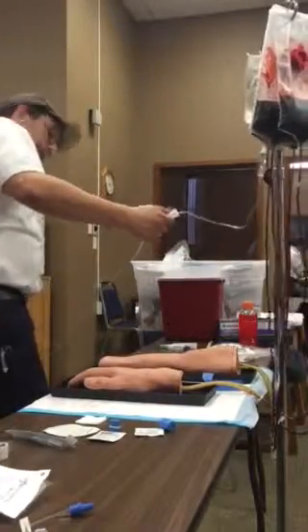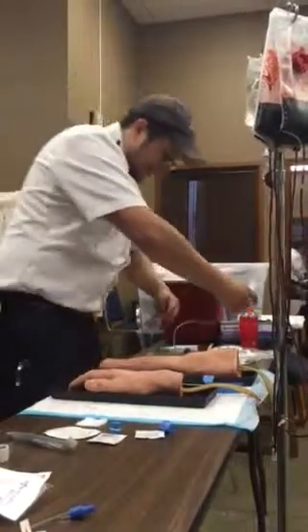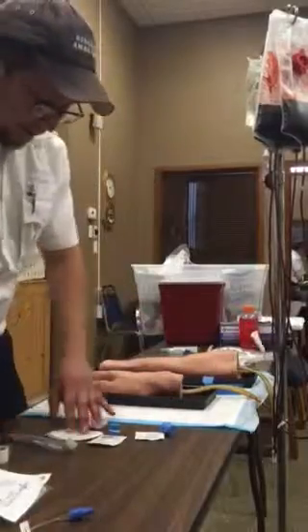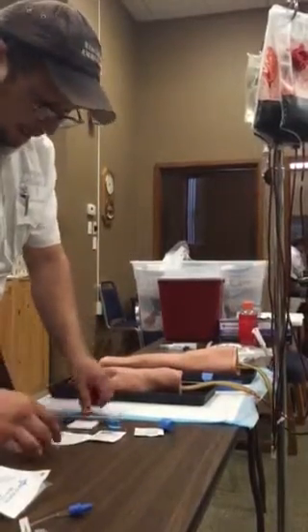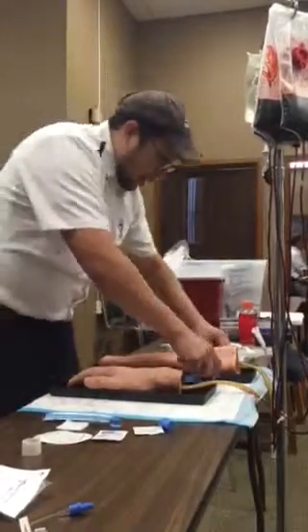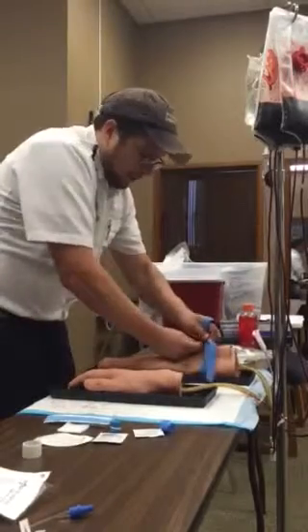I'm going to get rid of any excess air in my tubing. Flush my line there. And I'm going to gather my appropriate equipment here. Got needles, some tape, gauze, IV, or alcohol swab. I'm going to put a tourniquet on my patient, and I'm going to let him know that I'm going to put a tourniquet on him. I'm going to start an IV.